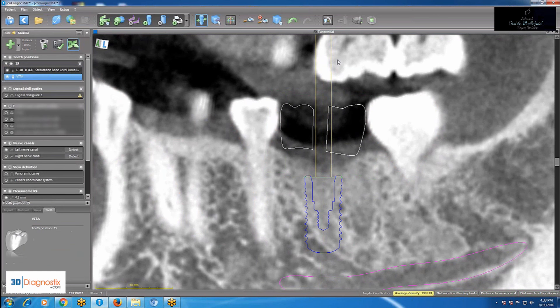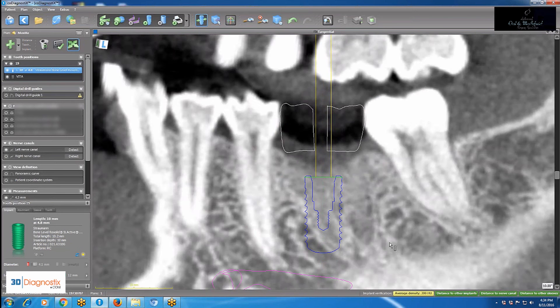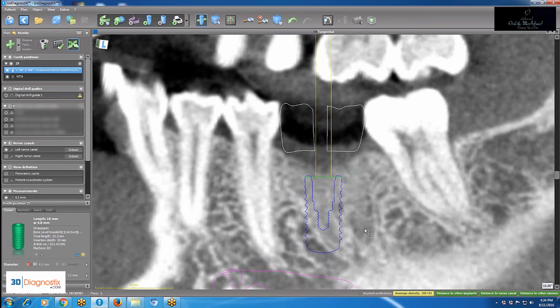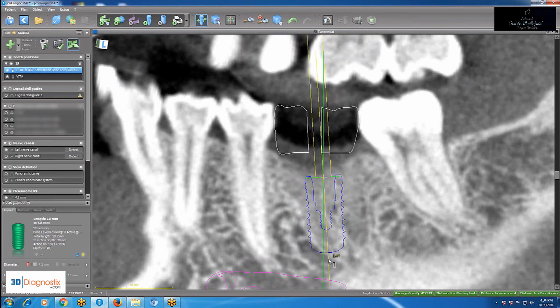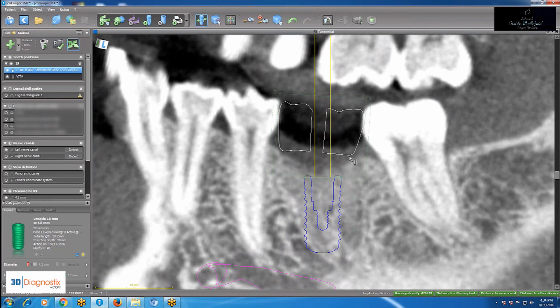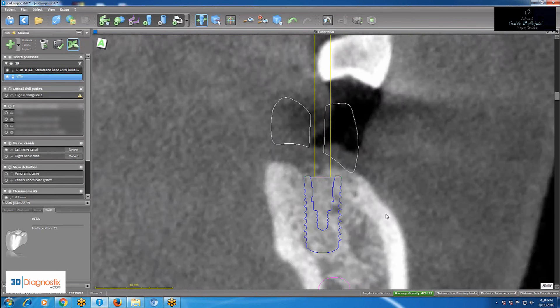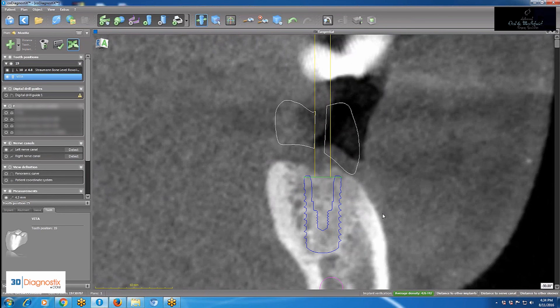Then I go to the tangential view, where I can view the implant from all different angles — 180 degrees all around — and still tweak the crown and implant to be in the most perfect position. The sockets are still visible, so I place the implant more or less in the previous sockets of the extracted tooth.